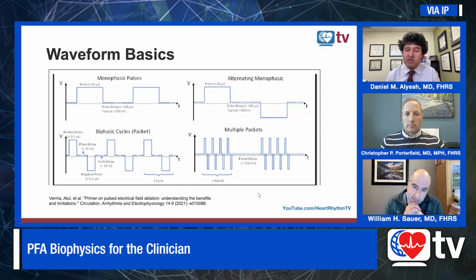This schematic comes from a very nice article by Atul Verma, published in Circ EP, where it breaks down all these critical components of PFA biophysics. And I'll pose this first point of discussion to Will Sauer. Can you go over the components of a PFA waveform and maybe a little bit of the clinical impact, which we'll elaborate on further in our discussion?